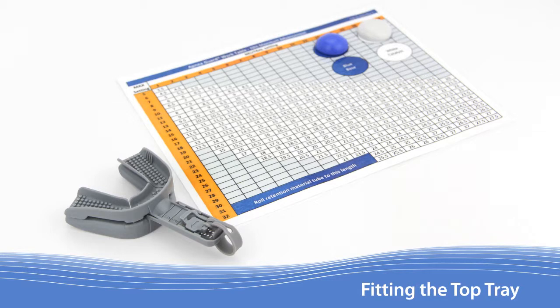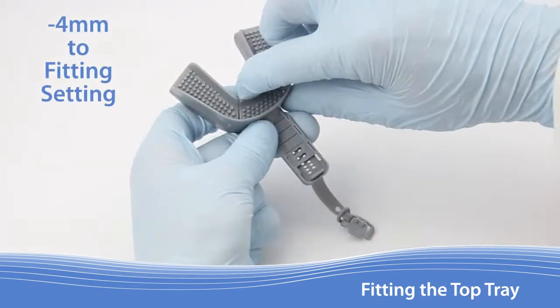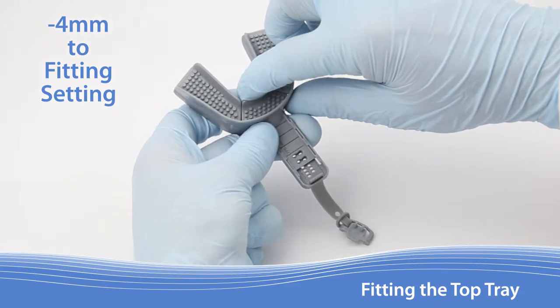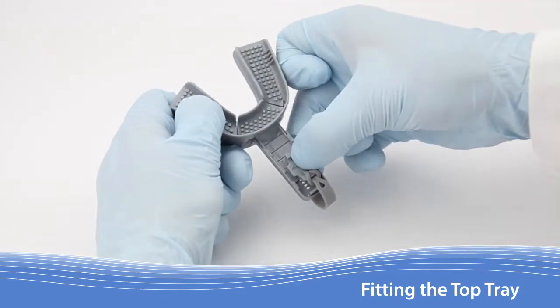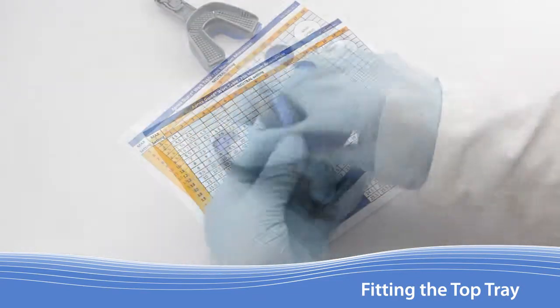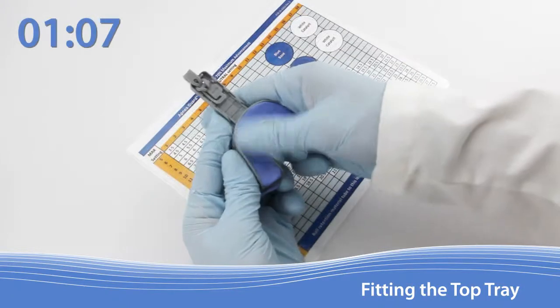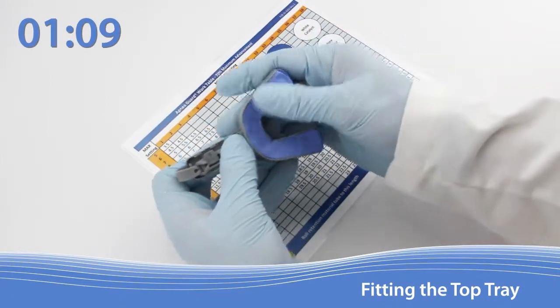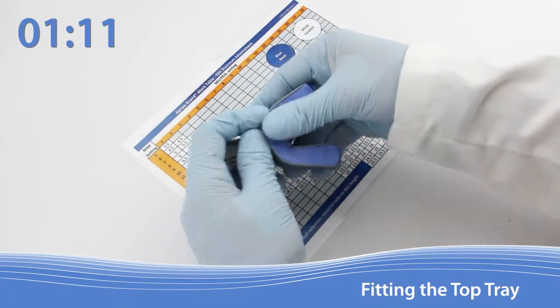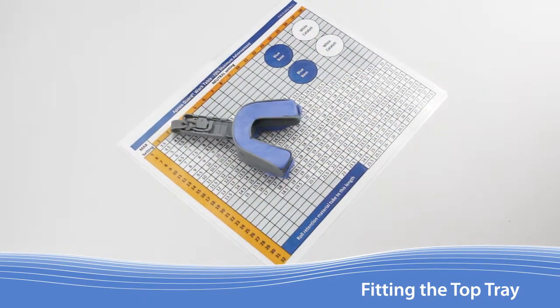With a good lower tray now made, follow the same procedure to prepare and distribute the retention material into the upper tray. With the top tray facing up, remove the lock, slide the upper tray forward 4 millimeters, and reinsert the lock into the fitting setting. Mix the material to a uniform color, distribute it evenly across the device, form the 90 degree angle in the back, and create a slight trough in the middle. Remember, you must complete all of these steps within 1 minute and 15 seconds from the start of mixing the material.